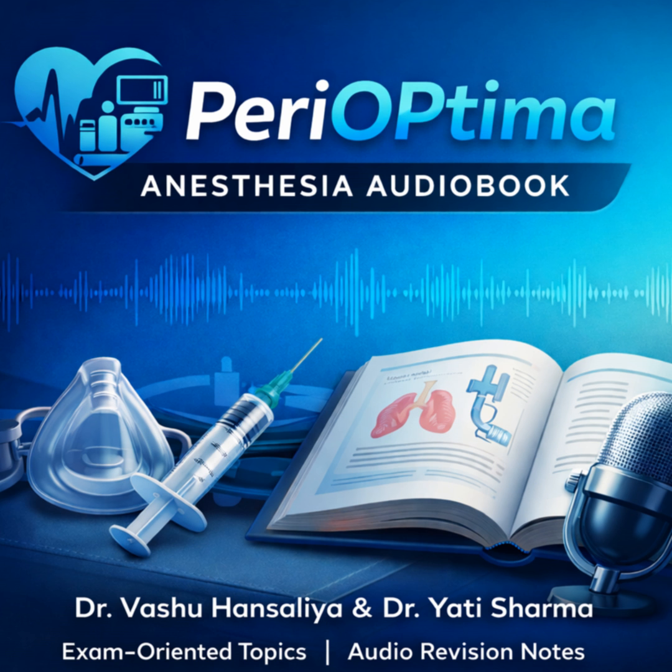What about ventilation and fluids? Any special considerations? Hemodynamically, the IABP is volume dependent. It works by displacing blood. If the aorta is empty because the patient is hypovolemic, the balloon has nothing to displace, so you have to maintain intravascular volume. And ventilation. For ventilation, avoid excessive PEEP if there is coexisting right ventricular failure, as it increases RV afterload. But otherwise, standard protective lung ventilation applies.